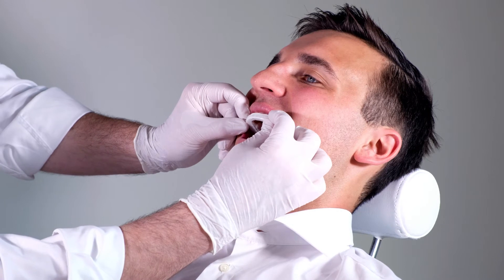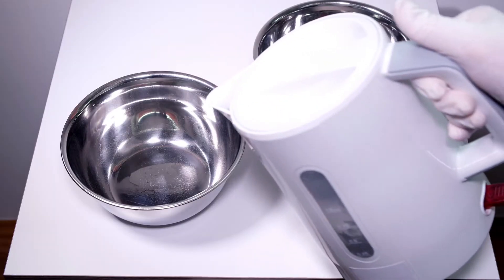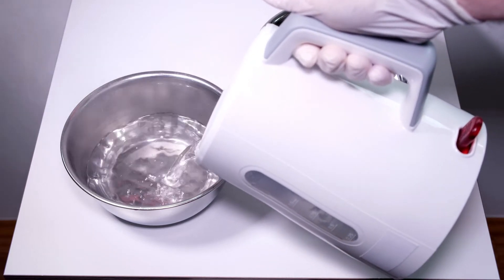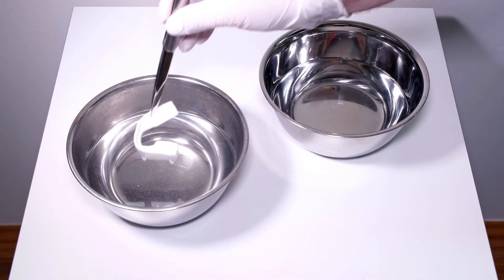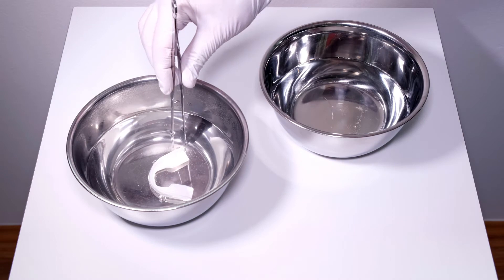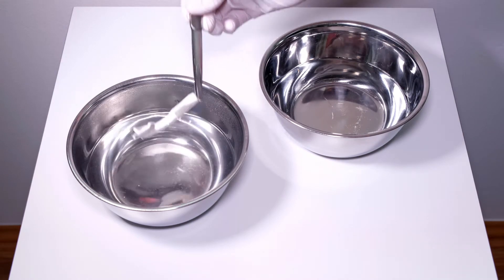Leave the upper tray on the teeth while fitting the lower tray. Replace the water in the hot water bowl with freshly boiled water, and reuse the water in the cold water bath. Put the second tray in the hot water bath for about 60 seconds, and once removed, allow it to cool down for about 60 seconds.